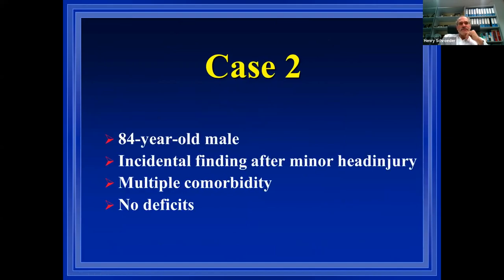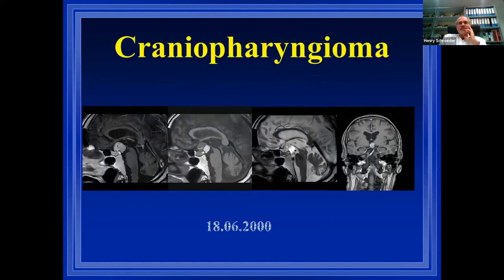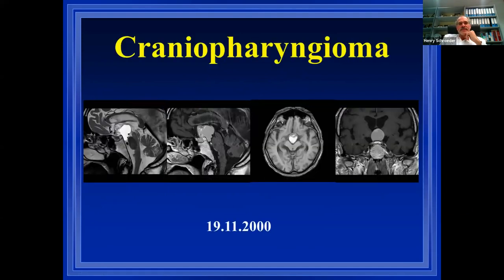So another case, this was an 84-year-old male, incidental finding after minor head injury. You see, that seems to be a craniopharyngioma, 84 years. He has no symptoms. So we said, we follow it. So this was June 2000, and then November 2000, you see, asymptomatic still, but large.